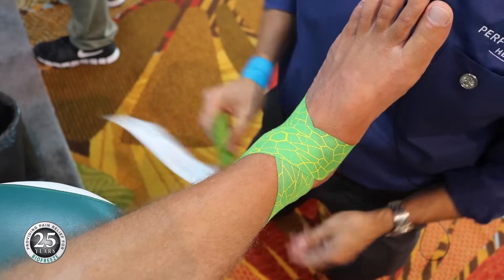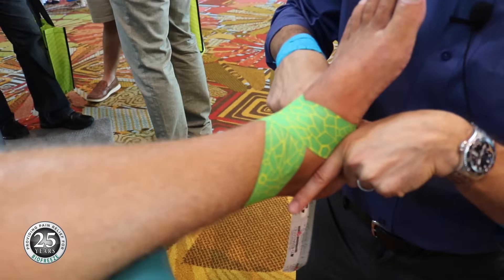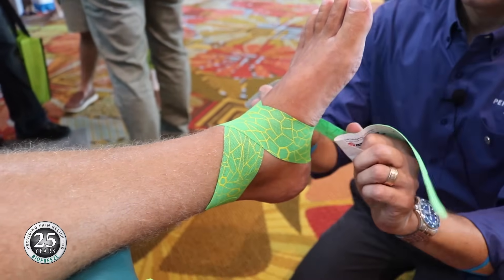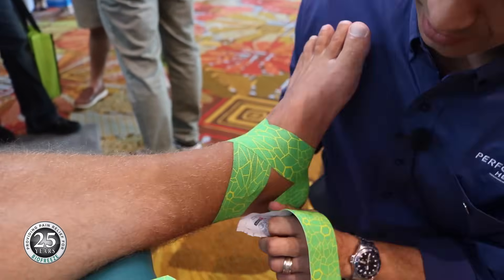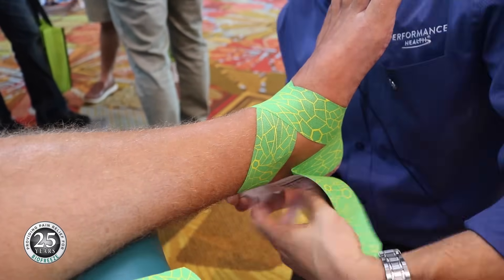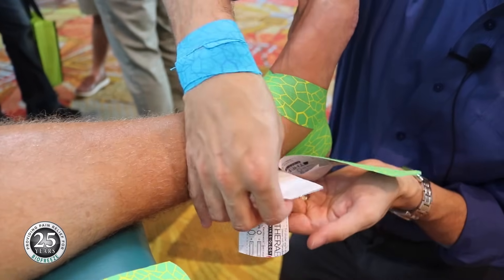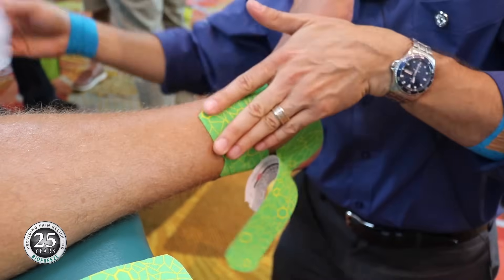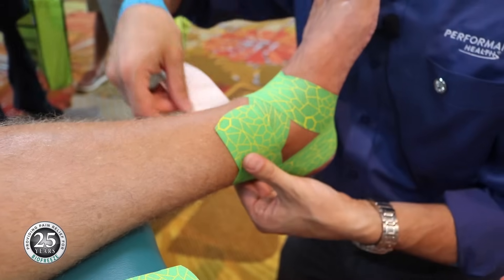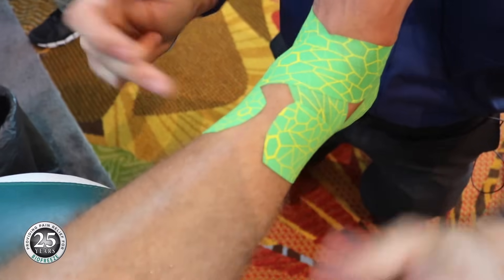With the second strip, we're going to go to the subtalar joint — the same exact vector, except now going back along the subtalar joint. Taking that tape and breaking it in the middle. It's really important that you overlap your tape so you always catch some skin. We've got that 100% stretch right behind the calcaneus, and then paper-off tension the rest of the way so we don't create any compressive load on the Achilles. Same thing — 100% stretch — and then paper off again, making sure we overlap onto the skin each time.